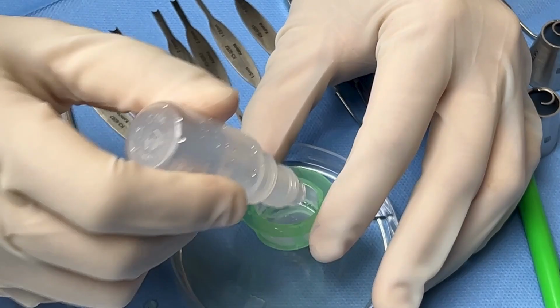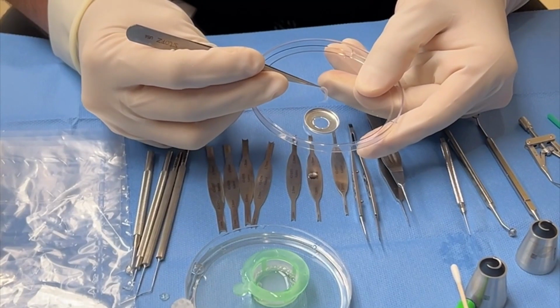So a lot of us that are doing this suppose that the tissue is not thoroughly rinsed. So really make sure that the tissue is clear of any storage medium that's not meant to be put into the channel. Okay, so this is your tissue.